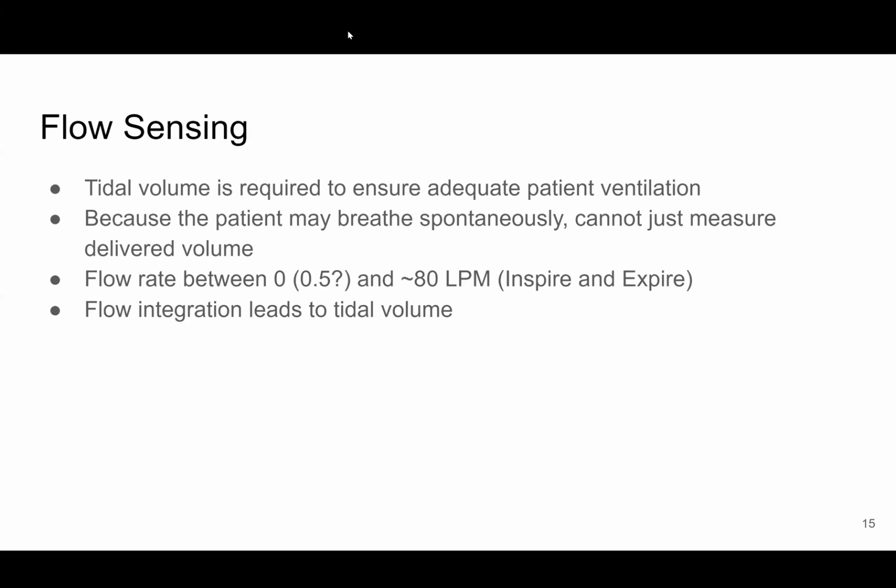And again, missing those edges could be okay. It decreases your accuracy, but obviously we don't want to do that. But if it totally simplifies the system to have a slightly less accurate volume integration, the volume is not a hard number. It's going to be patient lung dependent, and so if you're 5 milliliters over, you should be okay as long as you're monitoring other parameters, or if you're indicating 5 milliliters over. And then, as Edwin was talking, the flow integration leads to tidal volume, and so we need to track numerical error and linearity of response as well if we're doing integration.